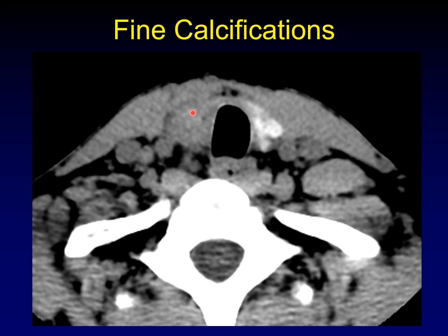Be careful not to mistake some residual thyroid tissue within a mass or encased by a mass for fine calcifications. This is not normal thyroid tissue taking up iodine — this is calcium in a very fine pattern.